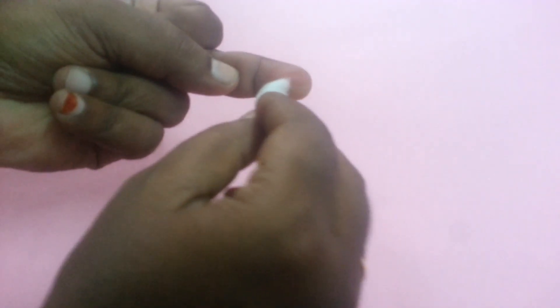Spirit swab. Let's go towards the procedure. Clean the finger with the spirit swab. Prick the finger with lancet.